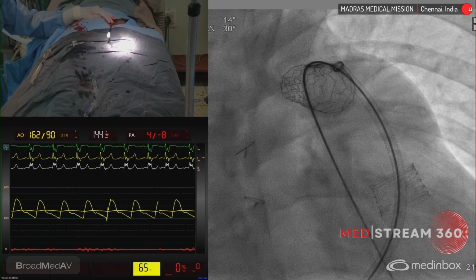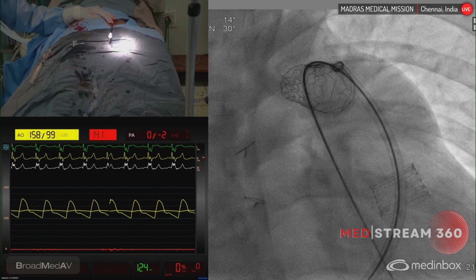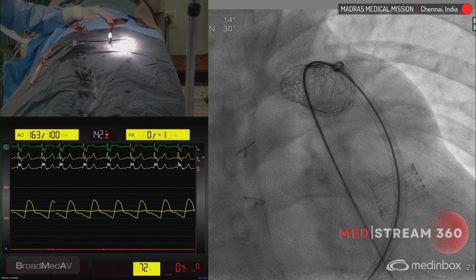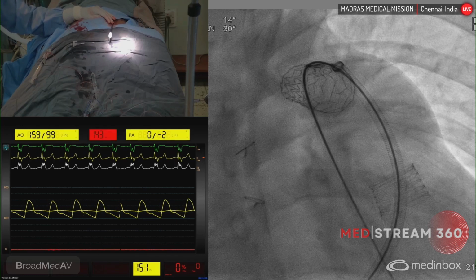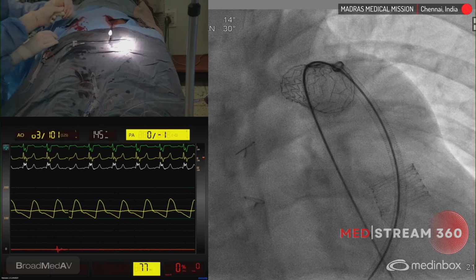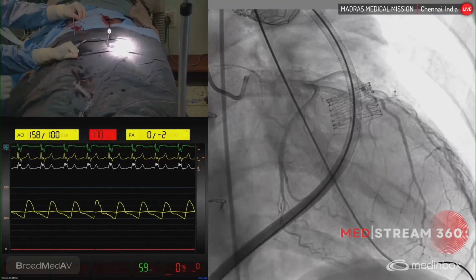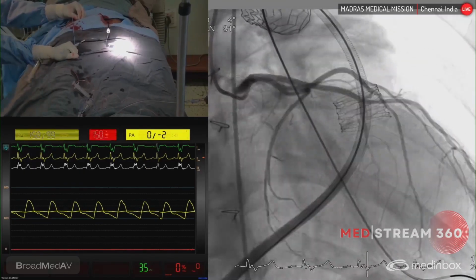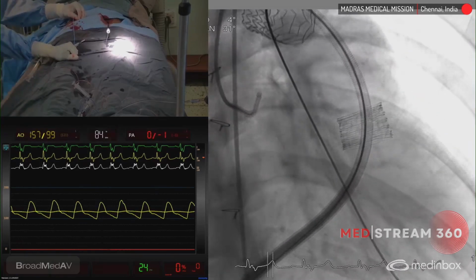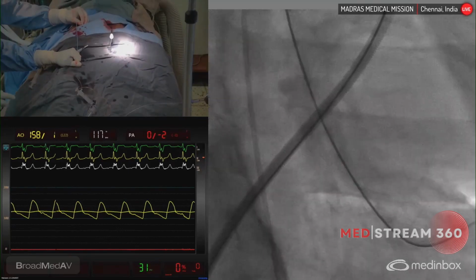We'll try to dilate now the main pulmonary artery stent to a diameter of initially 20 followed by 22. I will also make this an opportunity to study the left coronary artery. You can go into the coronary picture. The coronary seems to be far away. Can we get one caudal view? And make the main pulmonary artery stent come like a circle.